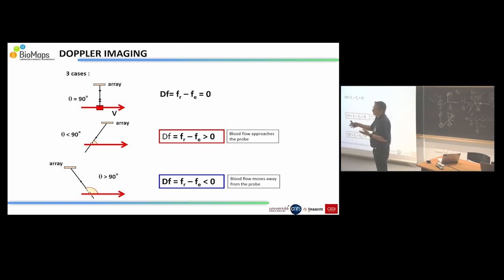So in the blood, of course, the bigger scatterers are the red blood cells, but if you have other things that can send back echoes, you will listen to that too. But whether I can differentiate them, I don't know. I just know there is something that's moving at this speed in the vessel, that's all. I say red blood cell, of course, because it's easier to understand, but if you have microbubbles, you can do the same thing with microbubbles.